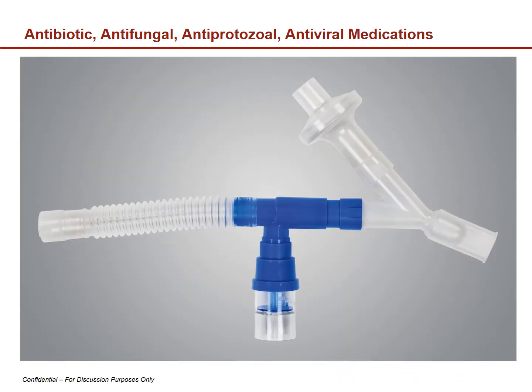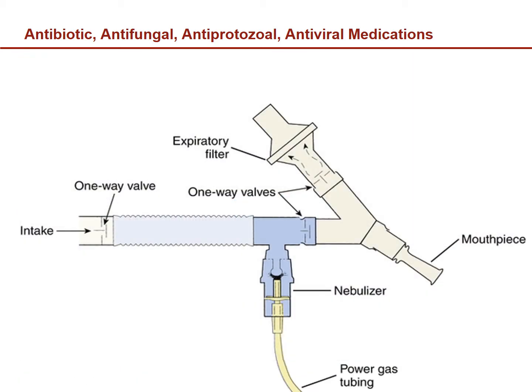The previously discussed antimicrobial agents require the respiratory care practitioner to wear an N95 or CAPR device when administering. To further protect the RCP from fugitive aerosol particles during the patient's expiratory phase, a filtered IsoNeb type nebulizer is used. A series of one-way valves and filters prevent the aerosol from entering the room during the patient's expiratory phase. The patient should also be coached to hold the mouthpiece firmly between the lips for the entirety of the treatment. The patient should also be instructed to cover his or her mouth when coughing.